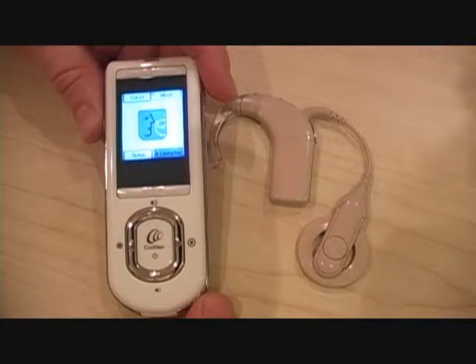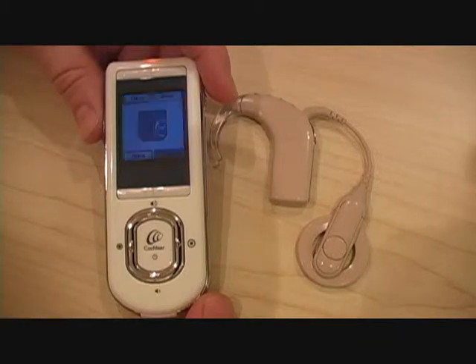In this segment, we'll discuss what to do if your N5 processor turns on, but you do not hear any sound. If your N5 processor turns on, but you do not hear any sound, you'll want to check your settings, the coil, and the cable to make sure they are working.